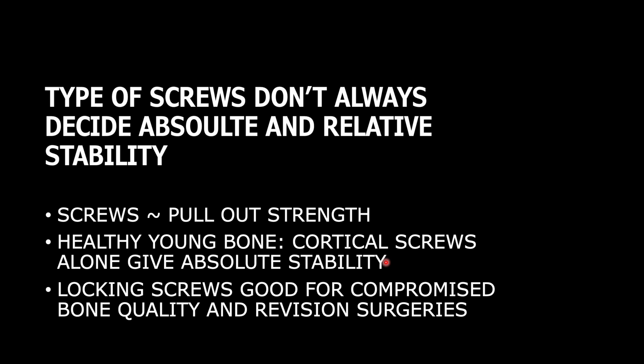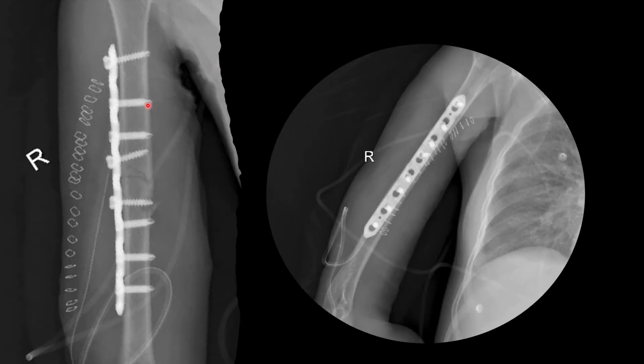In this example, the fracture has been satisfactorily reduced. Two locking screws are in the proximal segment, one cortical screw is in the terminal part, and three locking screws are in the distal segment. Three locking screws are sufficient for diaphyseal fixation because almost 50% of stress is absorbed by the nearest screw to the fracture, about half of that by the second screw, and stress on the third and fourth screws is negligible. The fourth locking screw is almost useless unless bone quality is highly compromised.